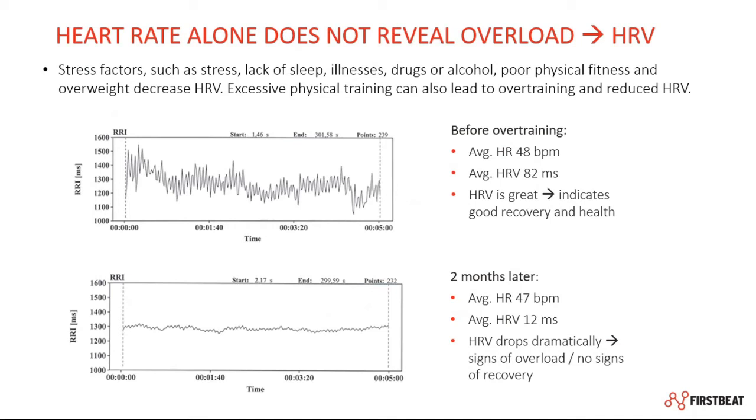And that can be a red flag for an athlete, but we utilize that same principle in the Firstbeat measurements that are done for normal people to try to highlight situations where the load is for some reason too high.